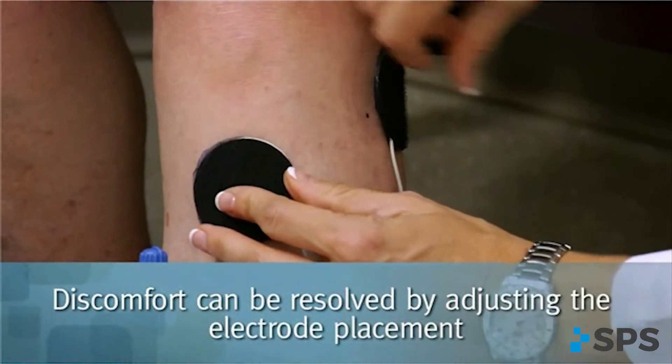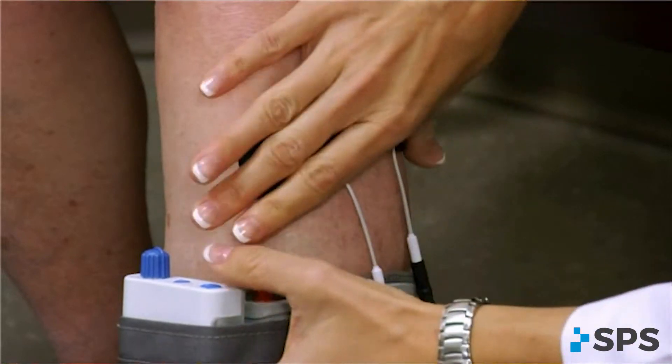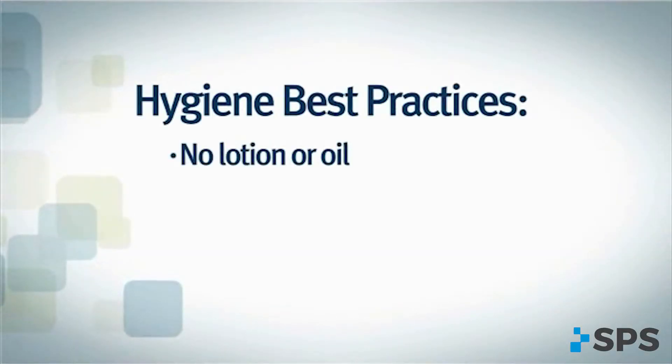The patient should be reminded about skin care, electrode maintenance, and intensity management. Before making any adjustments, discuss the patient's hygiene routine — soaps, lotions, shaving, and electrode maintenance. Lotions, soaps, and oils can inhibit stimulation from entering the skin, causing irritation.